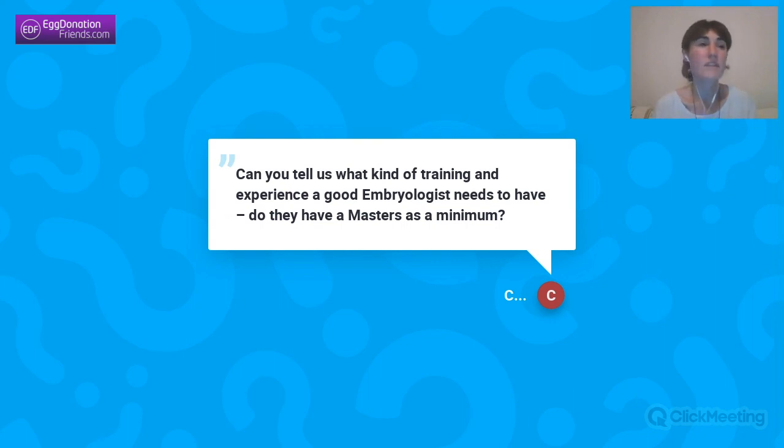I definitely think it's a help that they have had a theoretical specialization in assisted reproduction, because they need to understand what they are doing. All the decisions that they make, which consequences this can have for the embryo, what are epigenetics, what are endotoxins, I think you need to know what you're doing, and this will probably help.